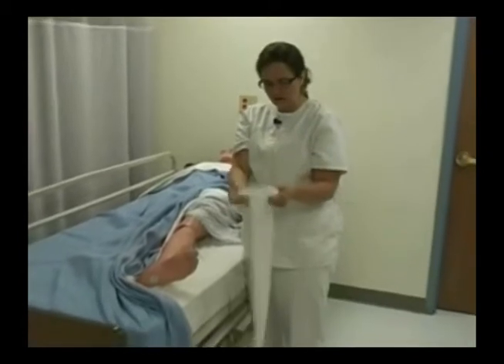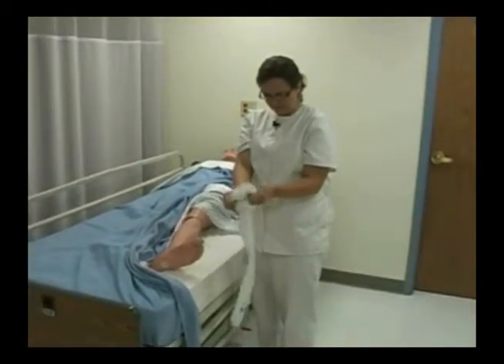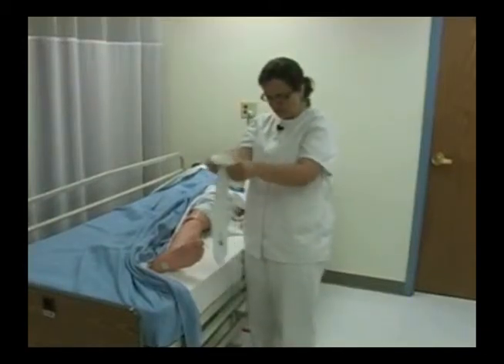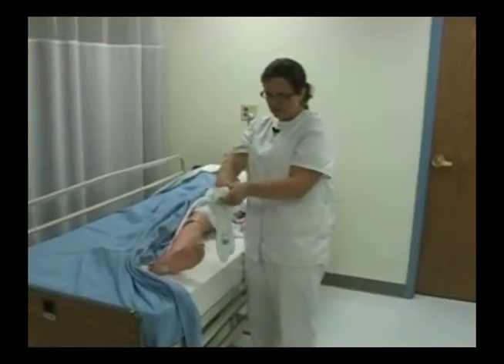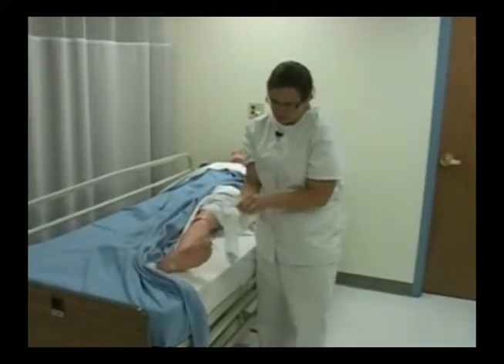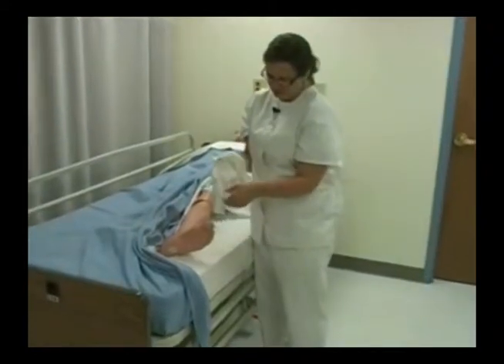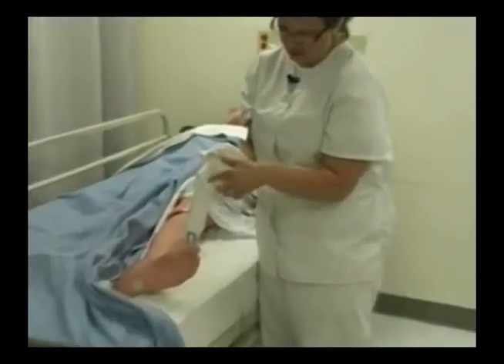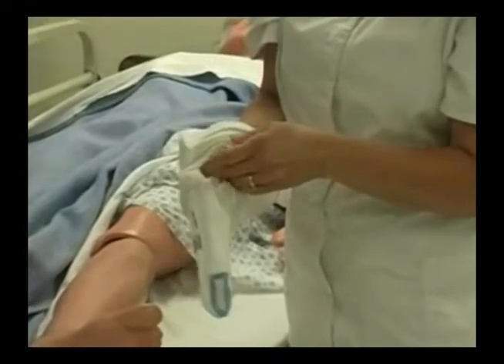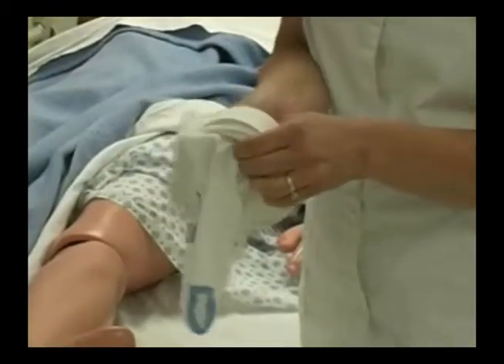So you need to gather your stocking up. You reach your hand in and look here — this is the heel pocket, right here. You're going to grab onto the heel pocket, then pull that through and let the rest of the stocking fall away.